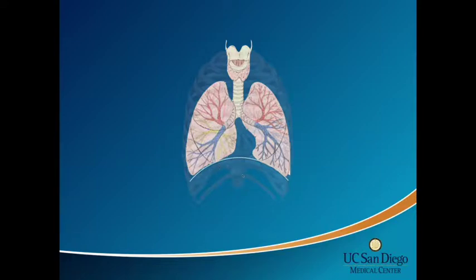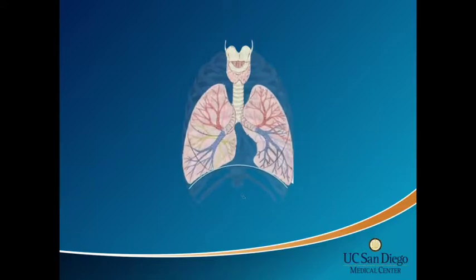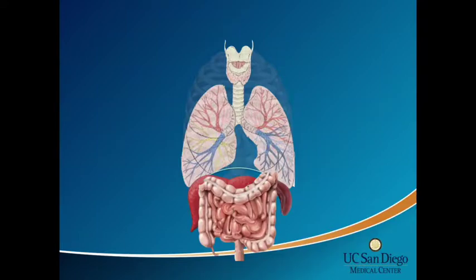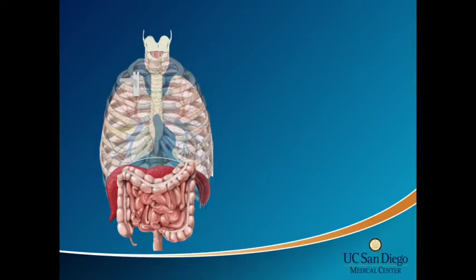And then we're all familiar with the fact that as the diaphragm moves, the lungs move up and down. And that's going to be relevant as we discuss how to use bedside ultrasound. Also, I'm going to draw in the bowels here as well, simply because they do come into play when you're using lung ultrasound. So lung ultrasound, there's really four positions. Position one, and you slide down. Position 2, and you slide down.